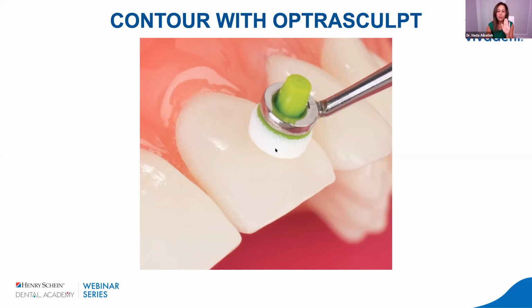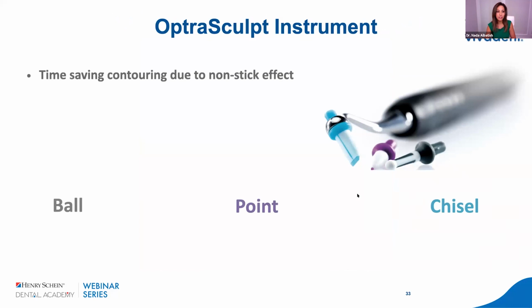You can use it to tap on those anterior teeth, and it's non-stick, so you get a fast, nice contour to those anterior teeth without incorporating any little ditches or lines that you might get if you're using a PFI or plastic instrument. I just love this for contouring my anterior teeth before we cure, when I'm doing cosmetic bonding. And then when I'm polishing at the end, I don't have to do a lot with my handpiece, which is really nice.